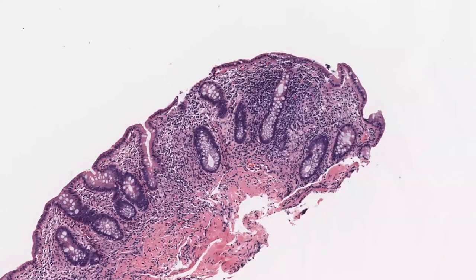But before I start this, this was a biopsy from a pouch, okay? Basically, I wanted you to try to interpret this now with me to see if you really understand how you are going to report this and what you are going to name it, right? So first of all, you look at this biopsy, and then I ask you a very simple question. Do you think that there is an inflammation in this, or do you think that there is no inflammation? And do you think there is architectural distortion, yes or no? These are two very simple questions. Whenever you look into GI biopsies, you need to ask yourself these questions.